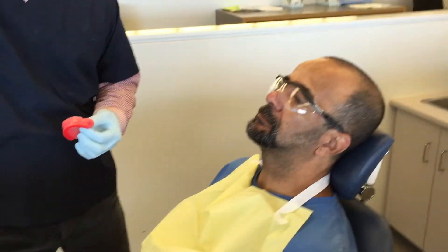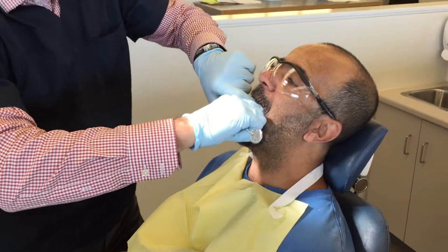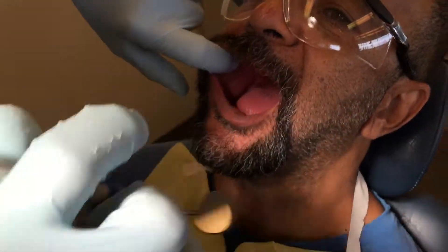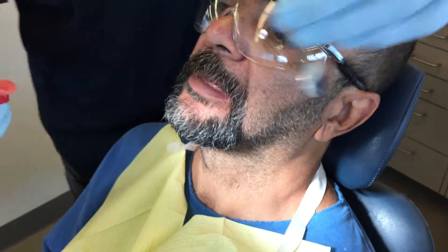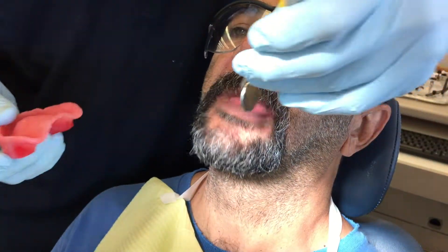We're going to take a quick look before we start, make sure everything looks the same, no changes to his oral condition. When you're working with the upper, you can lower the chair just a little bit, and then you can retract the cheek. I'm approaching the patient from the 11 o'clock position.